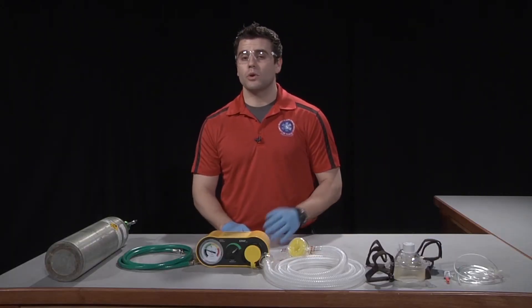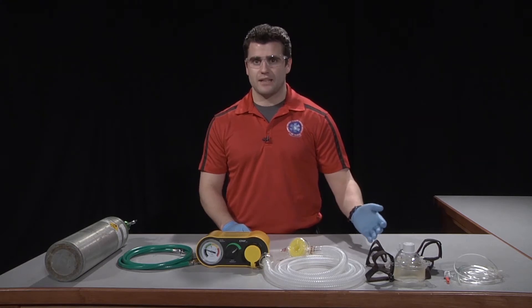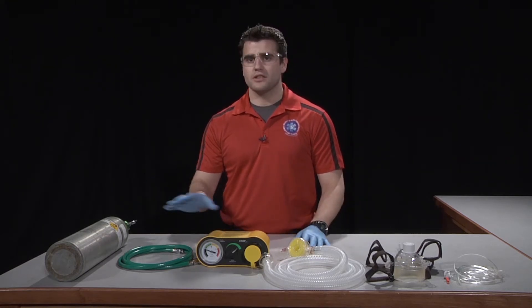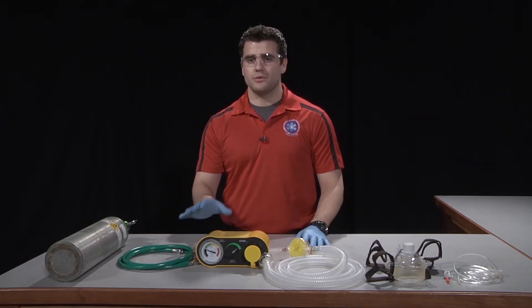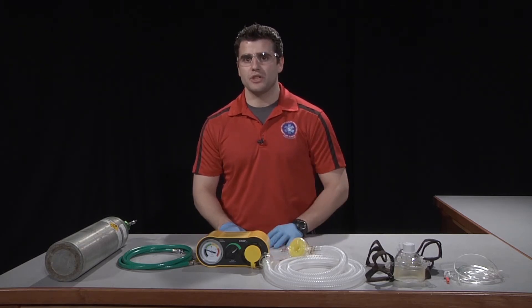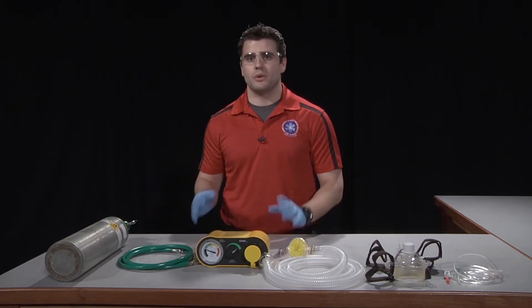From there, we're going to coach our patient on how to use the CPAP mask. We'll then attach our oxygen supply to the CPAP machine as well as the breathing portion to the CPAP machine, and then turn on the O2 and the machine. We'll then set the device parameters according to our local protocols and our manufacturer's recommendations.